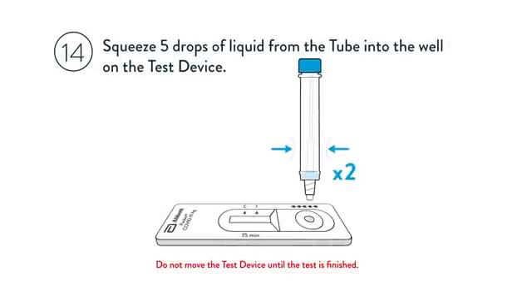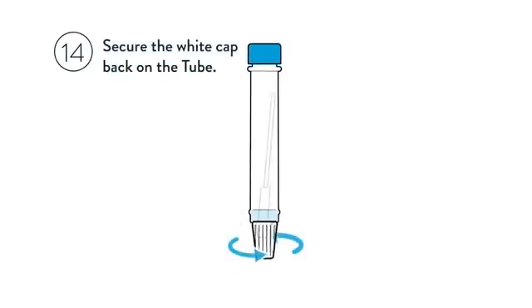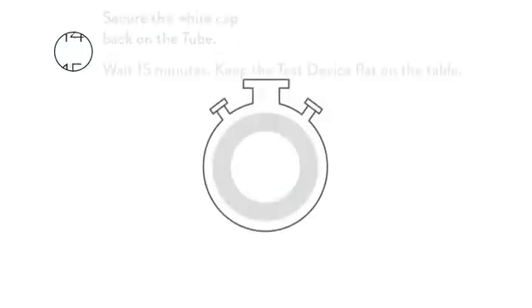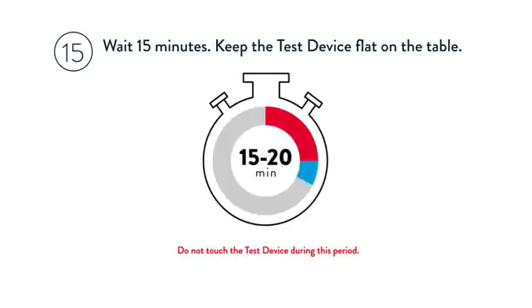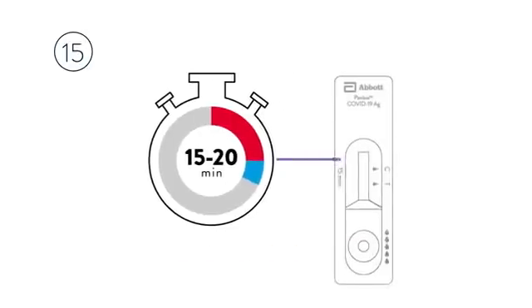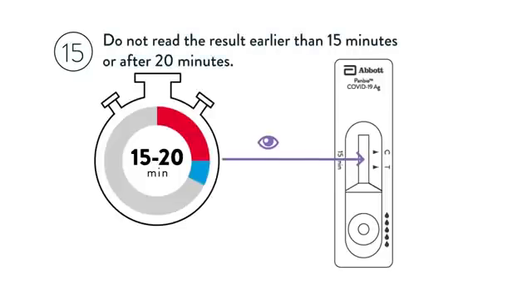Do not move the test device until the test is finished. Secure the white cap back on the tube. Wait 15 minutes, keeping the test device flat on the table. Do not touch the test device during this period. Read the result at 15 minutes — do not read the result earlier than 15 minutes or after 20 minutes.